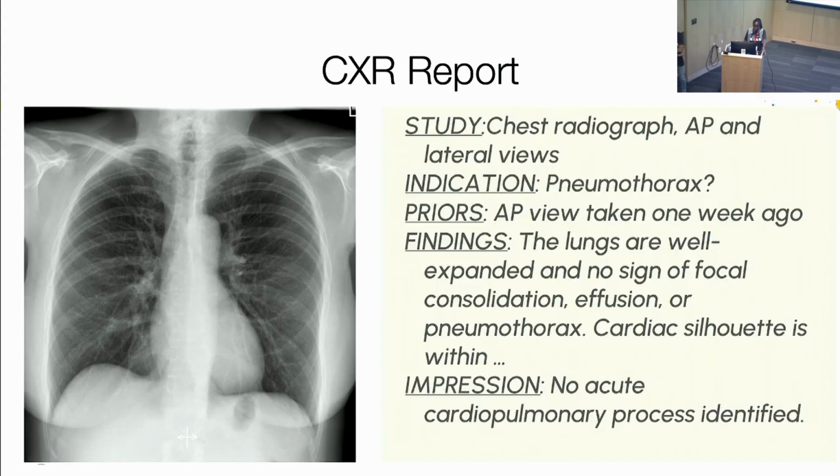Okay. So the other thing that you have to be careful about, and this was going to come at the end, is long-tailed classification, right? The rare things. And here, if you assume, truly, like the future, and this is a grand challenge, that AI serves to make things easier for us to help the radiologists, then probably most of us would still catch the big pneumothorax. But if you use just reports alone without validating with the radiologist, then you want the AI that, let me rephrase, a report that is normal and represents a missed finding, right?